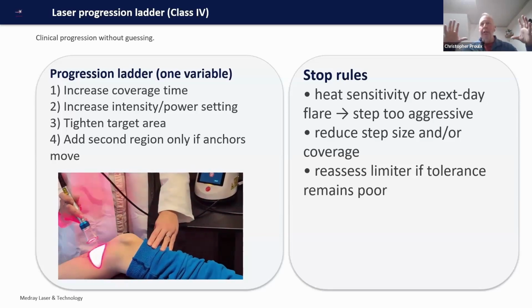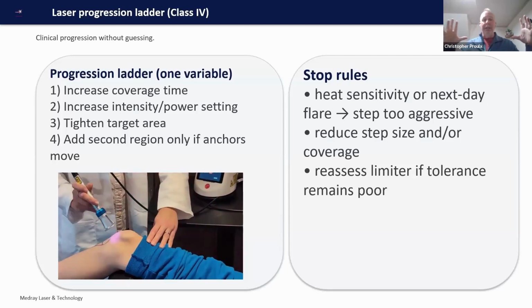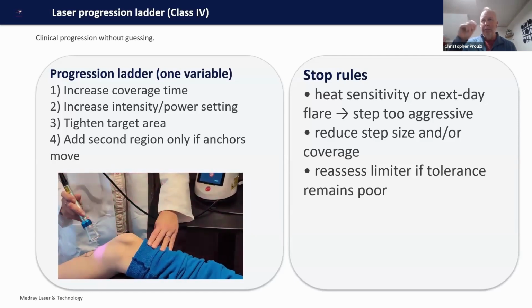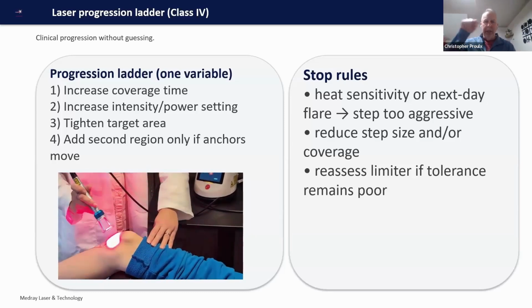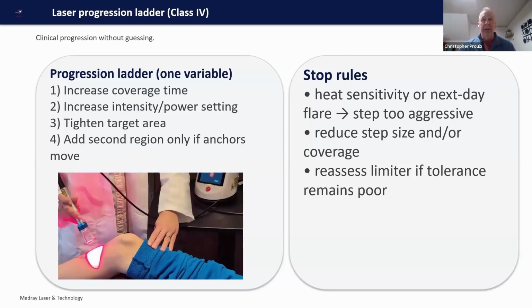So we may increase the area, especially if we're dealing with the pain in the early stages, and then we actually tighten it. We stick to the pathology. As I tell people, think like a surgeon when you're using laser and shockwave beyond that pain level, right? And really just address that tissue, because you can use some higher energy densities. It's going to decrease your treatment time quite dramatically.